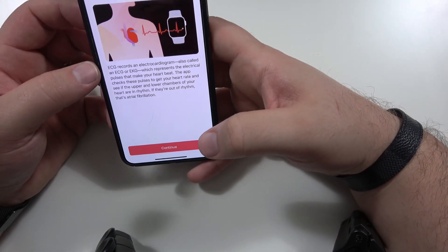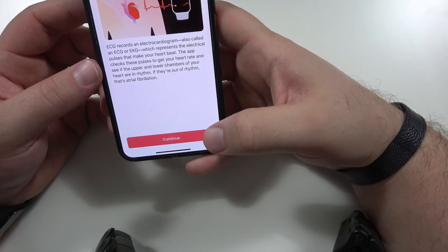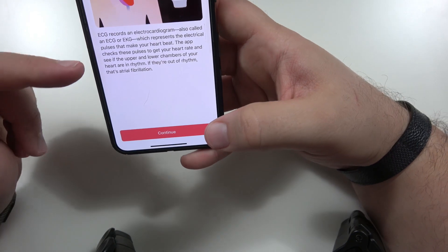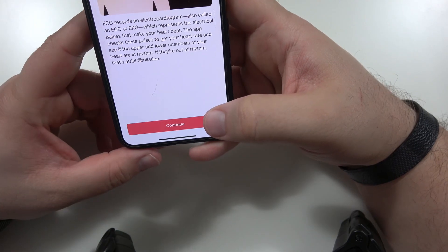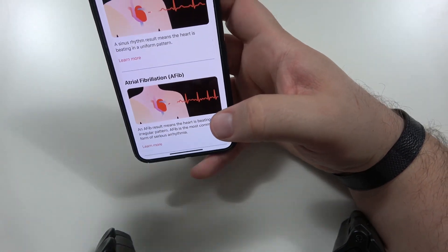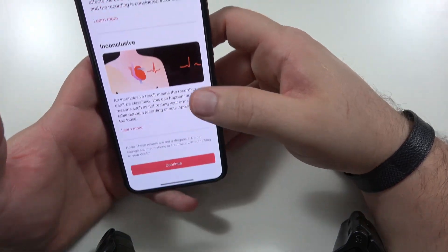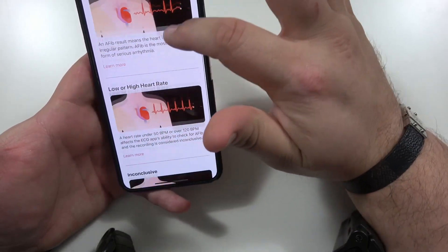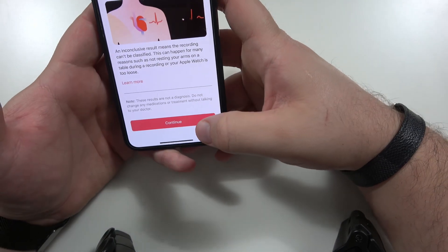How does the ECG work? ECG records an electrocardiogram — also called ECG or EKG — which represents the electrical pulses that make your heart beat. The app checks these pulses to get the heart rate and see if the upper and lower chambers of your heart are in rhythm. If they're out of rhythm, that's atrial fibrillation. The results shown are: sinus rhythm, atrial fibrillation (also known as afib), low or high heart rate, and inconclusive.